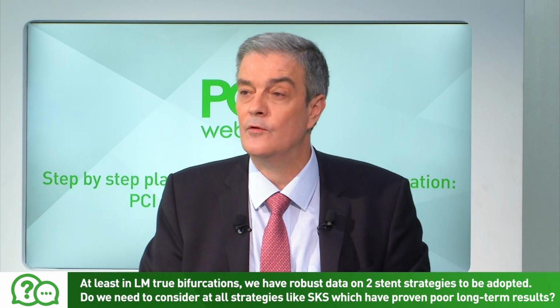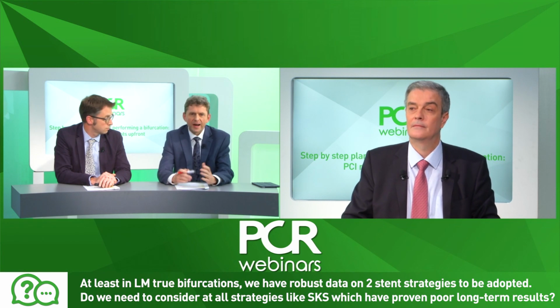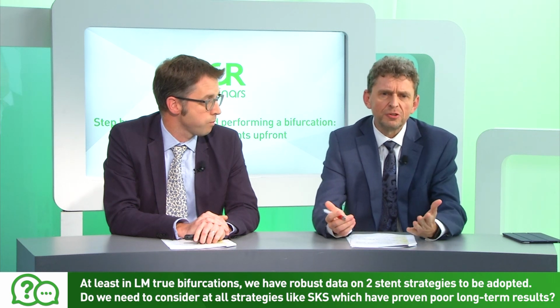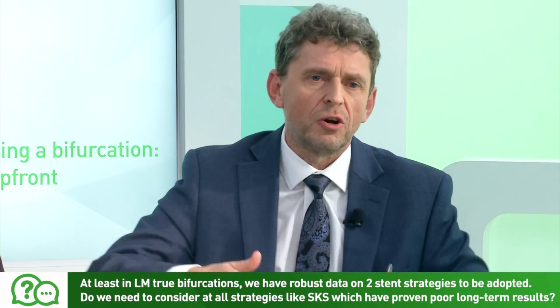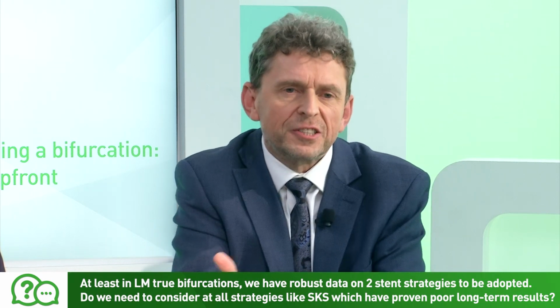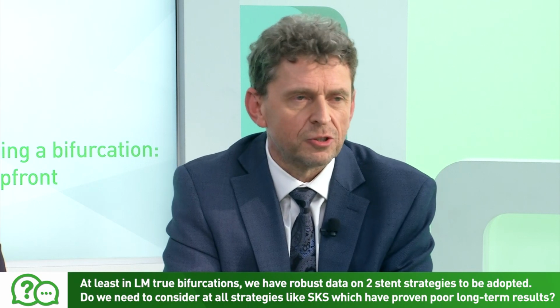Maciej, SKS in your practice? I'm not a fan of SKS. Actually, I never use this technique. I know there are some papers on that. I think the only use of this technique is when you want to be really very quick. You use a large guide like 7 or 8 French, and then you can go together with 2 stents simultaneously and fix the lesion and patient problem within seconds. Yeah? So that's the only reason.